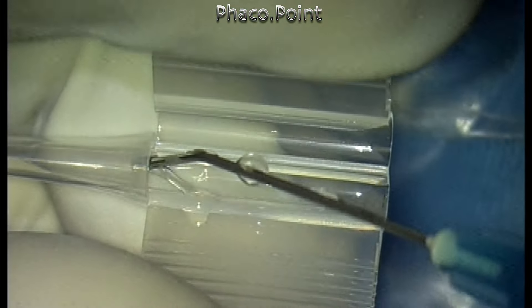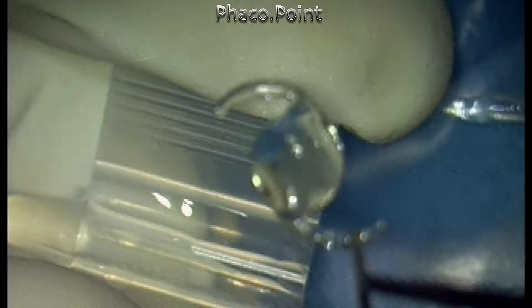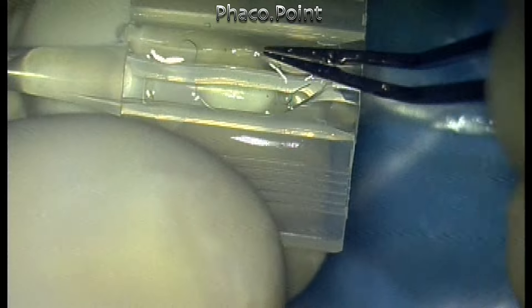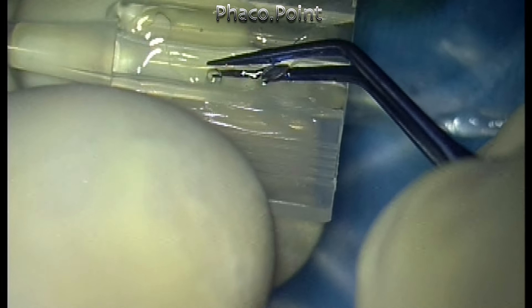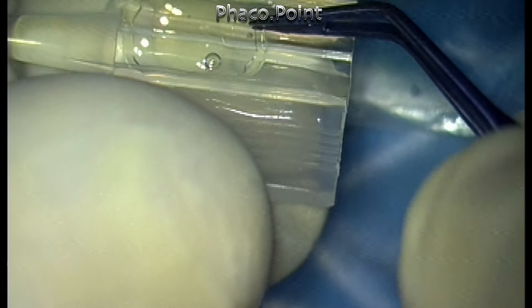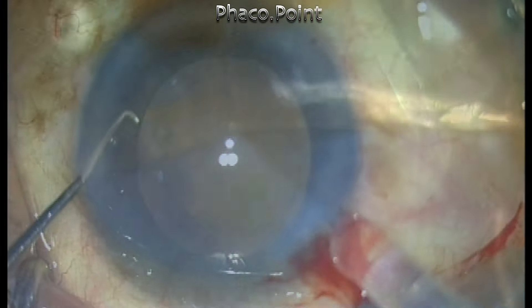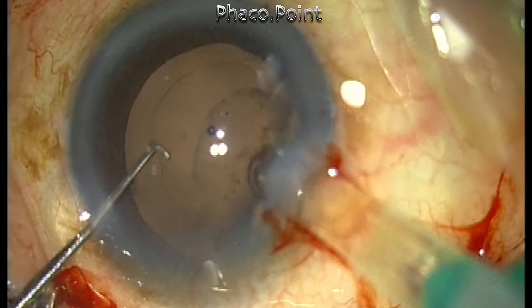I decided to load it in a fresh cartridge. I stored the lens in balanced salt solution as a temporary measure. The lens is now loaded into a fresh new cartridge — the standard cartridge we use for indigenous hydrophobic acrylic IOLs — and injected into the eye, and everything goes smoothly.